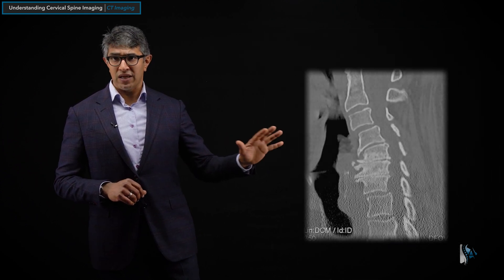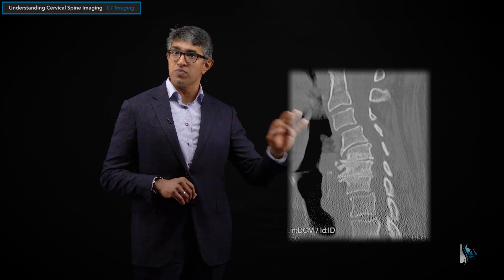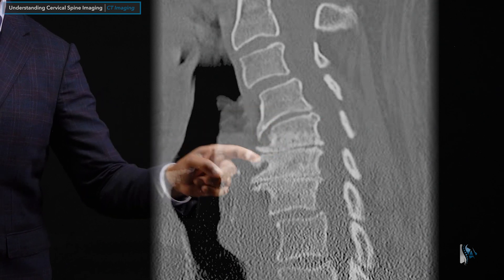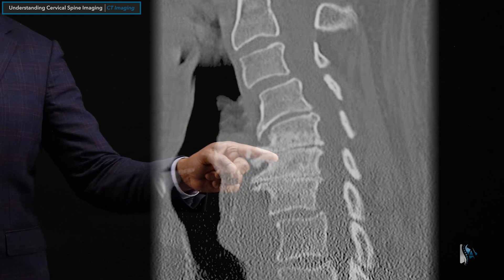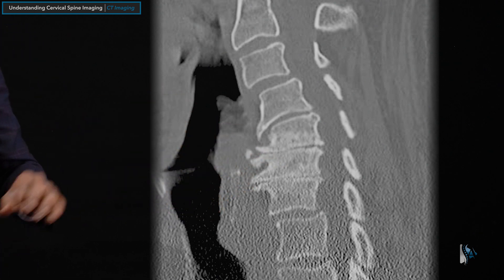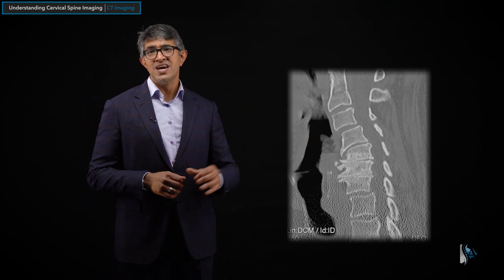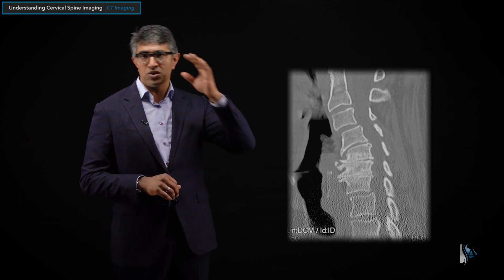Not every case has to be traumatic. This is a CT scan through somebody with advanced degenerative disease, or cervical spondylosis. When you look at it, you can see the disc is a bit worn out at the C4-5 level; at C5-C6 there's almost no disc at all. There are some reactive osteophytes — little bone spurs in the front. CT scans are excellent for looking at bony anatomy, but not great for soft tissue structures — you can barely see the spinal cord or spinal nerves. Together with an MRI scan, it gives you a very complete tomographic picture of what the cervical spine looks like.